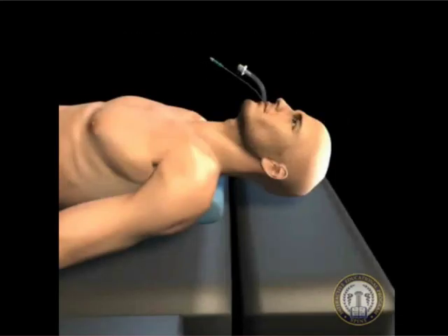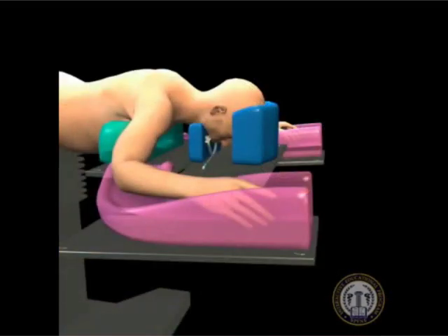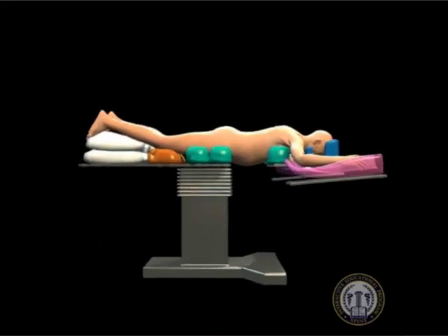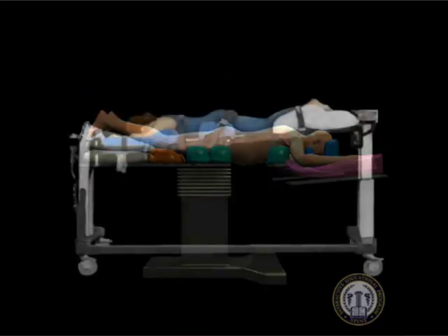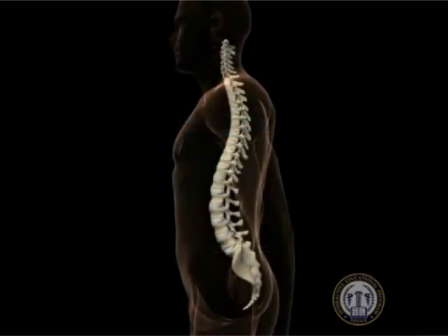Following induction of general endotracheal anesthesia, the patient is carefully turned to the prone position on a radiolucent table. The operative table options include either a standard table with chest rolls placed to maintain lumbar lordosis, or a Jackson-type table that places the hips in extension. Either option must maintain lumbar lordosis.